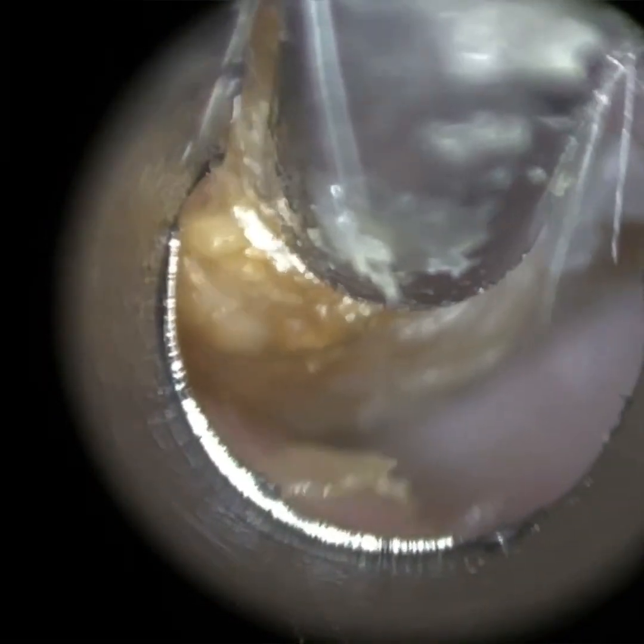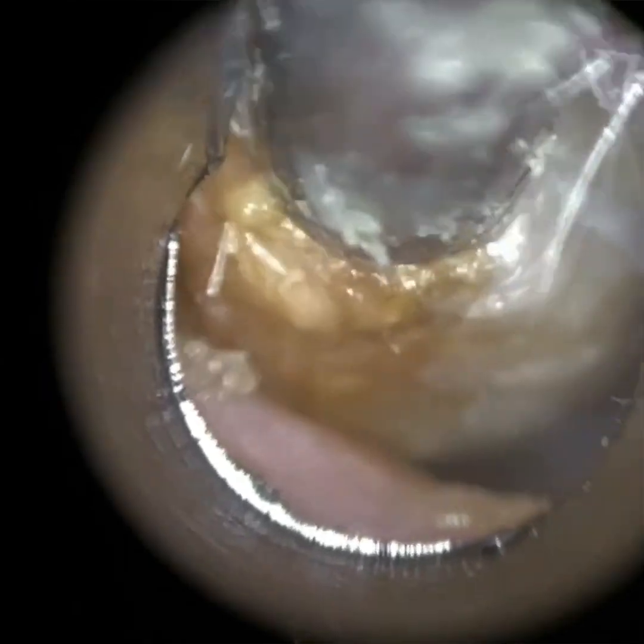During the course of this video, I'm going to explain why I've developed the Waxcope, the purpose behind it, and the motivation behind it.